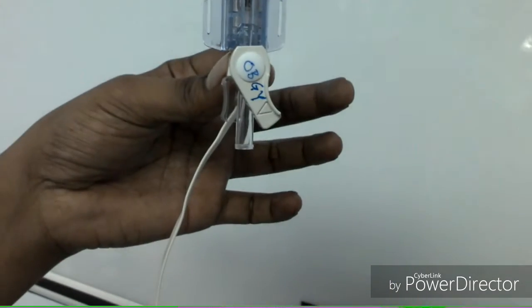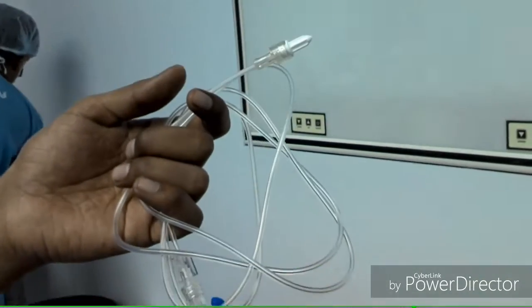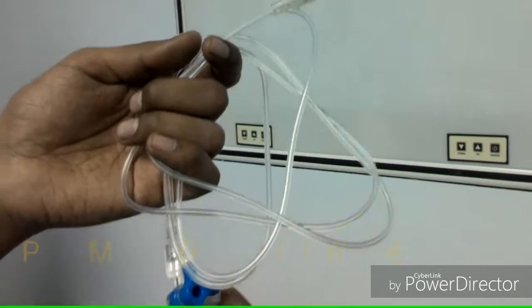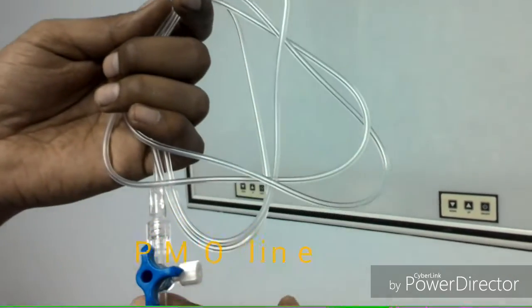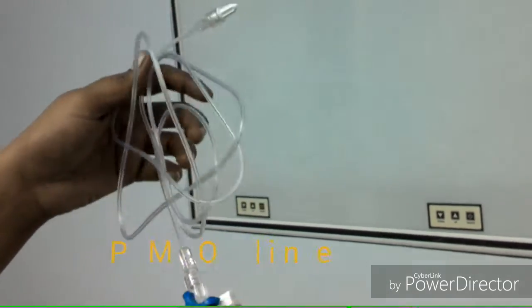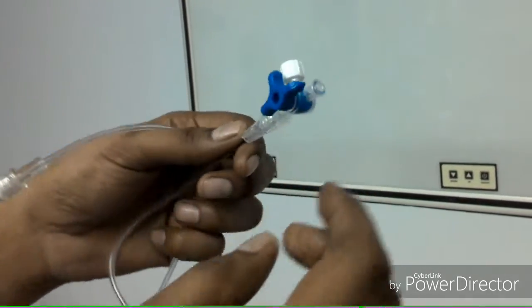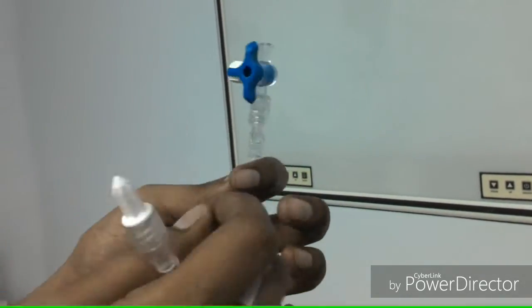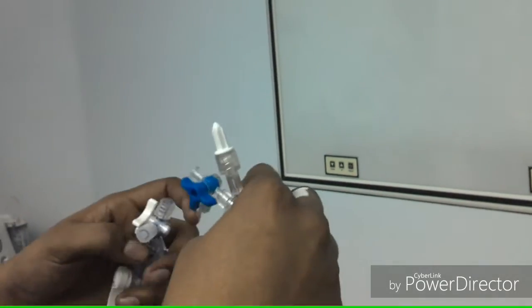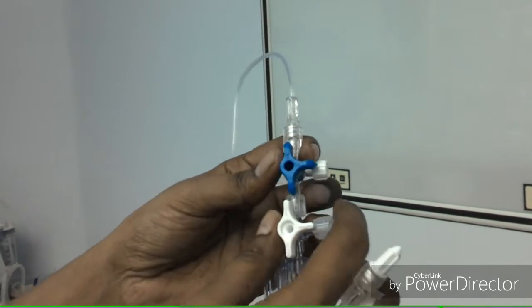A pressure transducer is a simple device which converts mechanical pressure into electrical signals. When we press the switch of the gas lighter, it presses piezoelectric crystals. The piezoelectric crystals generate electricity and produce a spark, igniting the gas.